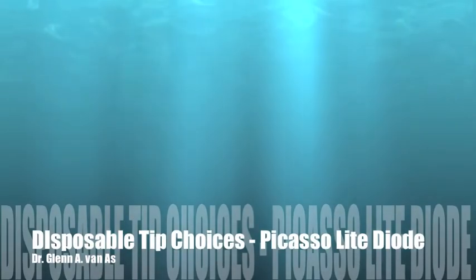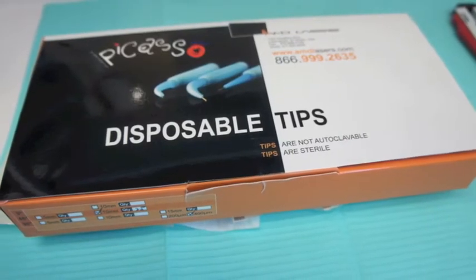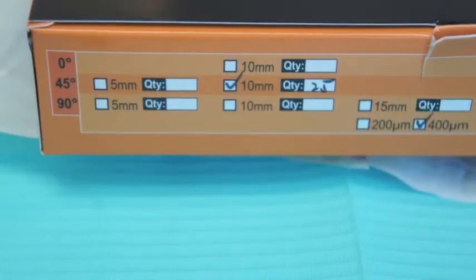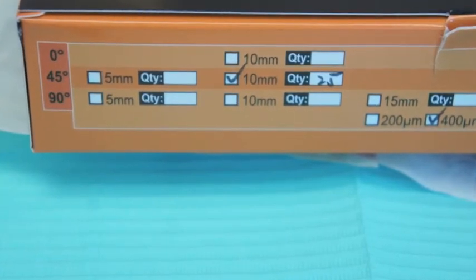Welcome to another edition of Blazing is Amazing with Dr. Glenn Vanass. Today we're going to talk about the Picasso disposable tips. They come in a box here in assorted sizes and in assorted quantities of 25 in each box.